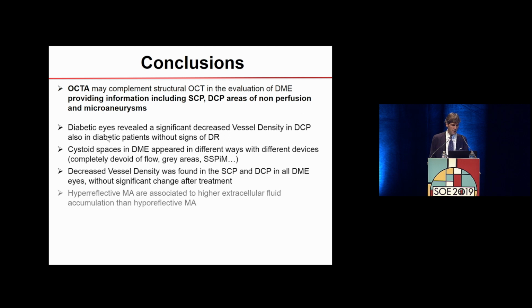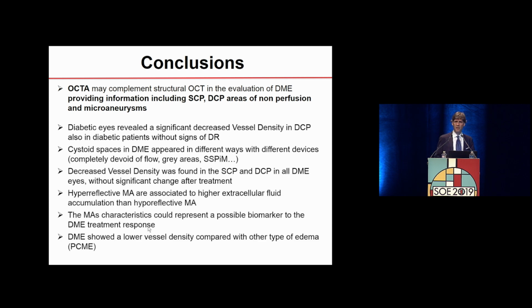So to sum up, OCT-A is nowadays a very important tool that we have in our hands to make diagnosis and to follow our patients with different aspects of diabetes and diabetic macular edema. We can probably detect the very early signs of diabetes in diabetic patients by using OCT-A that otherwise could not be detected with structural OCT or with fundus examination.